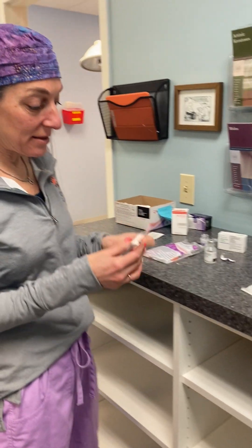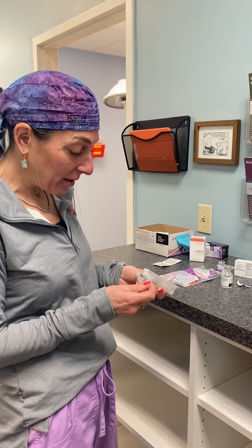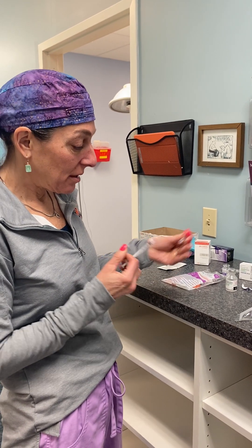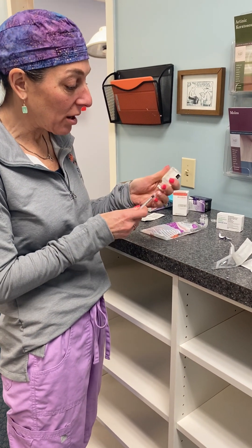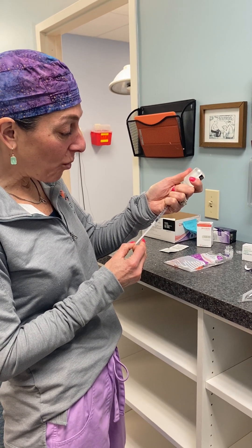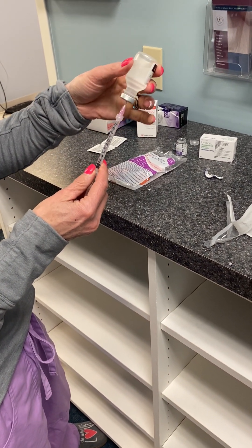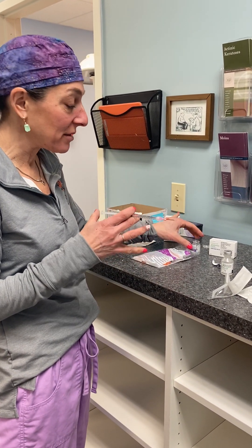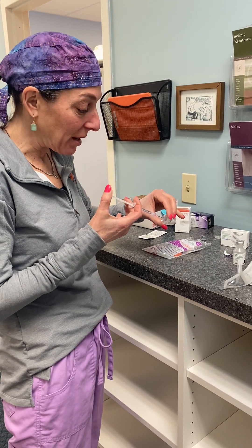You're going to use one cc to reconstitute both Botox and Dysport — the dilution for Jeuveau is a little different. I recommend drawing up just a little more than one cc — about 1.1 or 1.2 — because if you inject exactly one cc you can lose a little product in the bottle. Drawing a little extra gives you wiggle room and doesn't make a difference in your treatment.